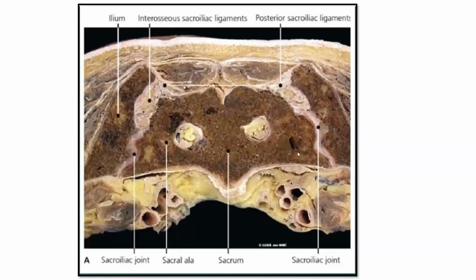Again, the anatomy looks serpentine in terms of how do you get an implant into this articular portion of the joint, and it is actually a cut that shows in a view that is not true when you actually access the inferior portion, which is much more linear, as I showed on the last CT scan.